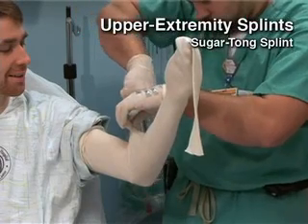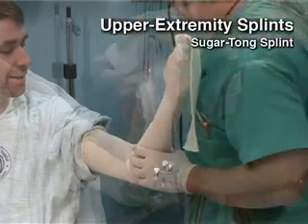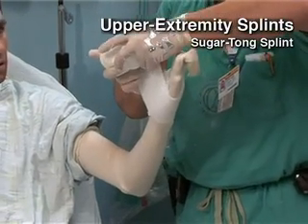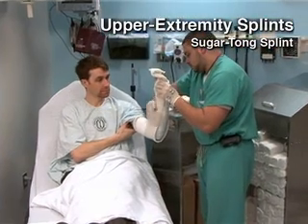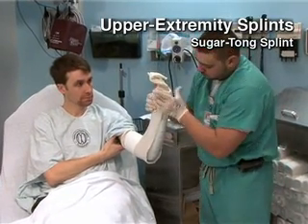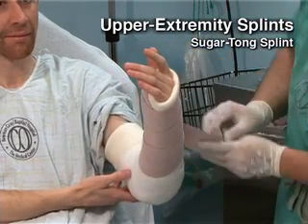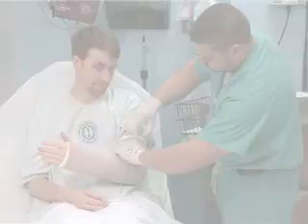A forearm sugar tong splint is used for wrist and distal forearm fractures. It immobilizes the wrist and forearm and prevents supination and pronation of the forearm. The splint extends from the metacarpophalangeal joints on the dorsum of the hand, along the forearm, around the elbow, and back to the volar aspect of the mid-palmar crease. Place the elbow in 90 degrees of flexion while maintaining a neutral position for the forearm and wrist.